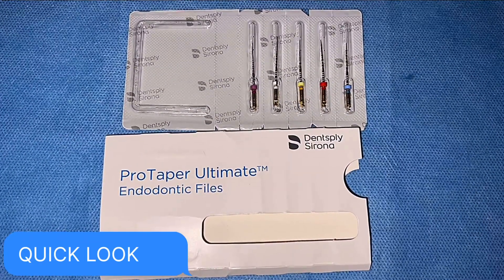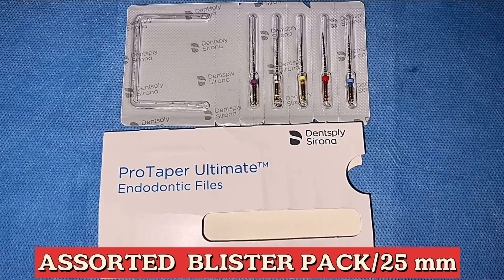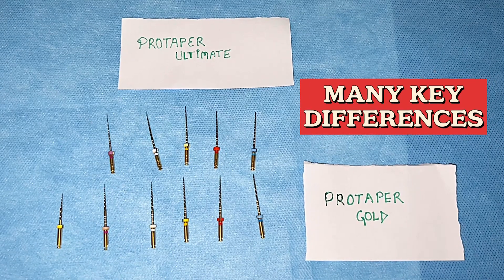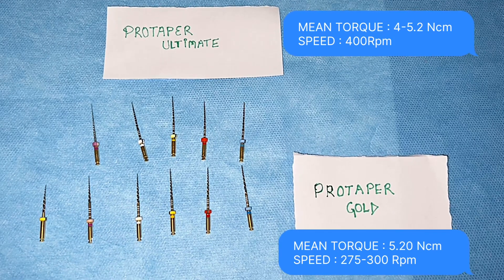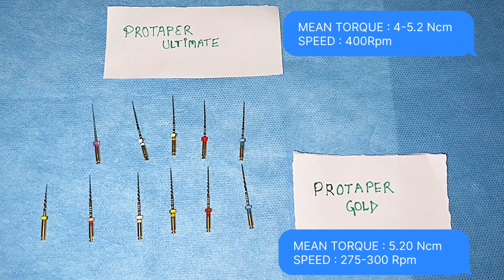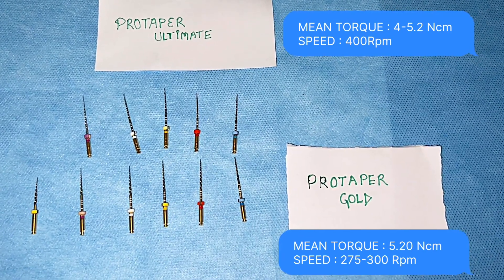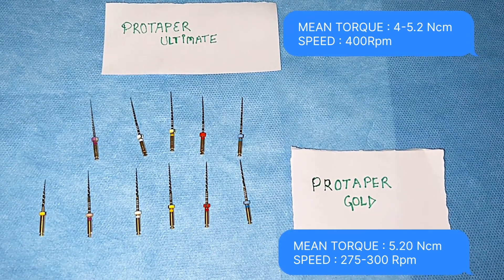Now the unboxing part. We get the Pro Taper Ultimate Endodontic files in a blister pack. The length of each file is 25mm and we get a total of 5 files. On the upper front we have Pro Taper Ultimate Series and on the lower side we have Pro Taper Gold Series. Pro Taper Ultimate Series has a mean torque of around 4 to 5.2 Newton cm, whereas the speed is 400 RPM, and it is the same for all the files.